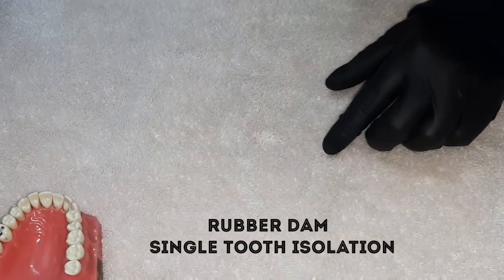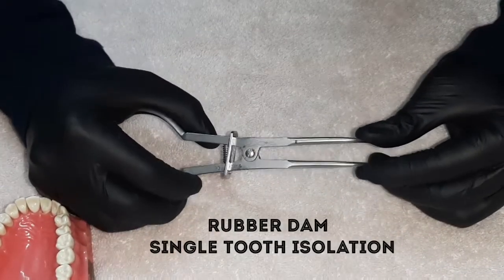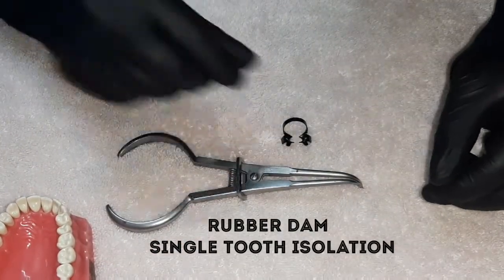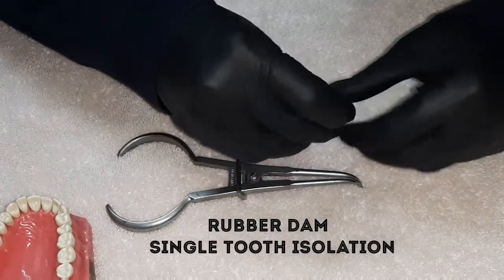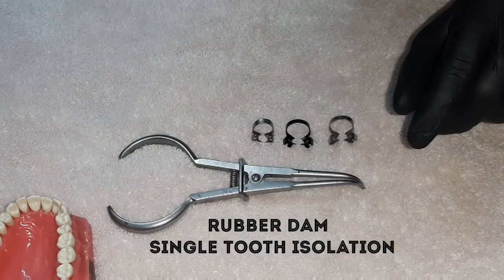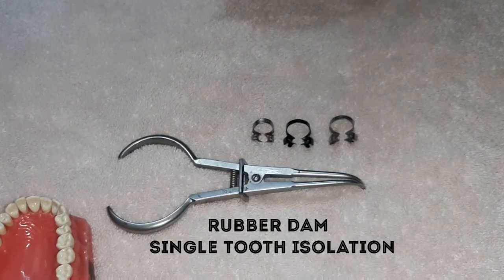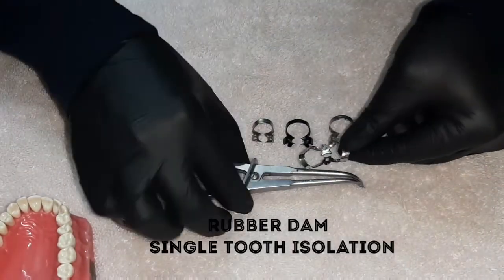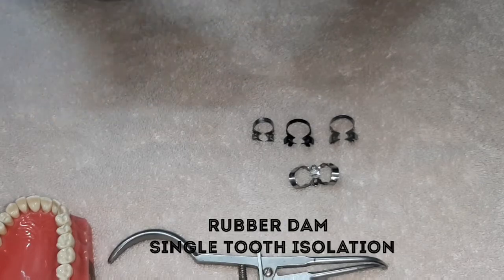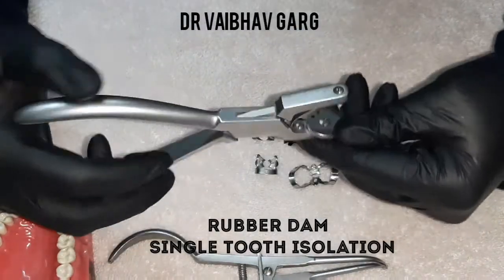Let me introduce you to the basic parts of rubber dam. This is a clamp or a forceps — we use forceps for the clamps. In rubber dam we have different clamps: we have wingless clamps and winged clamps. We have special clamps for anterior teeth and special clamps for pediatric teeth, premolars as well.